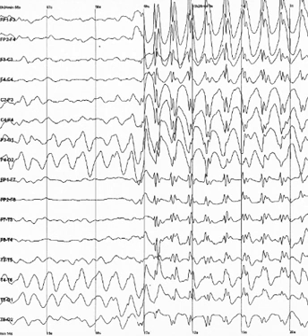Linked ears, which is a physical or mathematical average of electrodes attached to both earlobes or mastoids. Average reference montage. The outputs of all of the amplifiers are summed and averaged, and this averaged signal is used as the common reference for each channel.